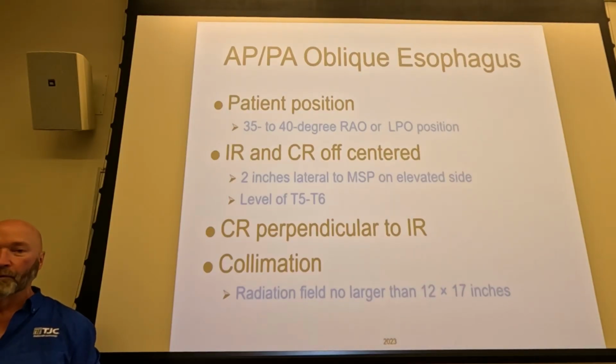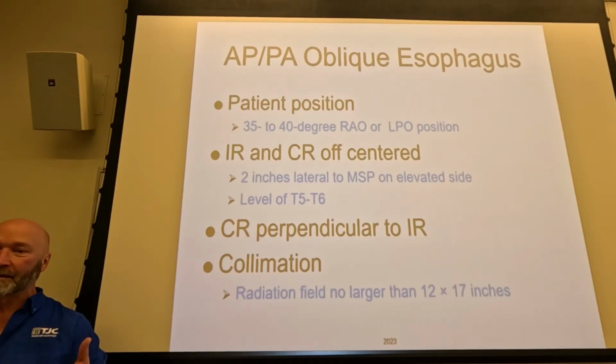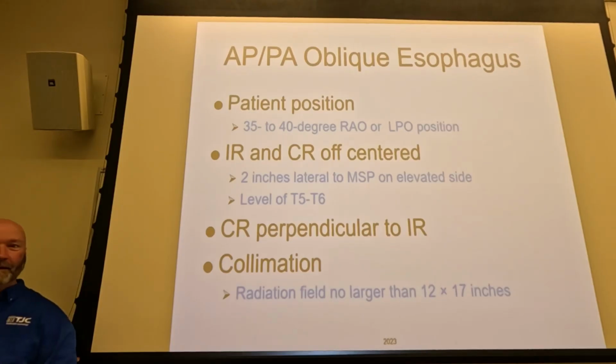So before they throw those away, snag them, put them in your locker. It's a lot easier to get the esophagus full. It's a lot easier to get, be it barium or the iodinated contrast, into the back of the mouth, off of the tongue. The patient doesn't taste it nearly as much. It's better for the patient, it's better for you, better for the exam. Get some of those straws next time you see an order come in. Anybody seen those things? No, you haven't. Why? Because it's thrown away.